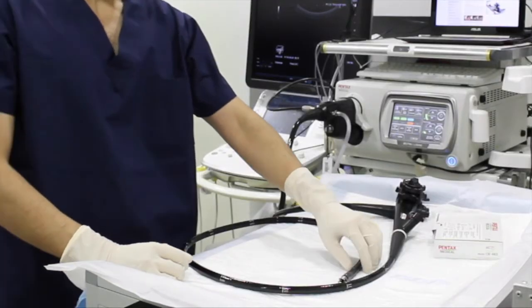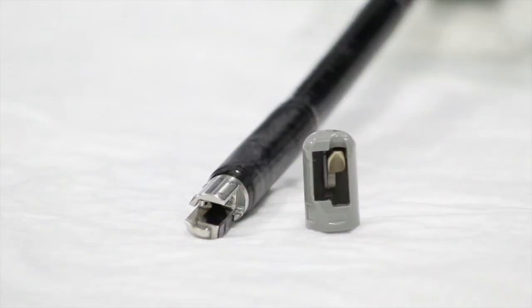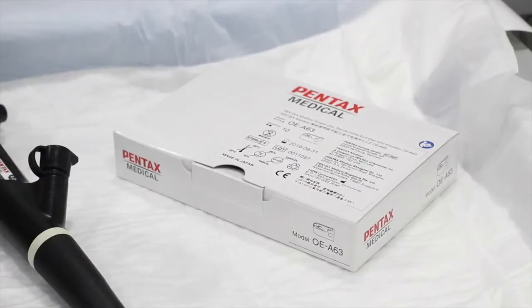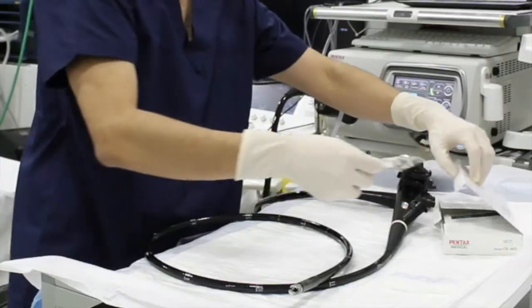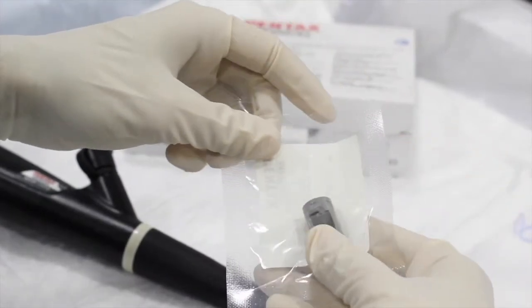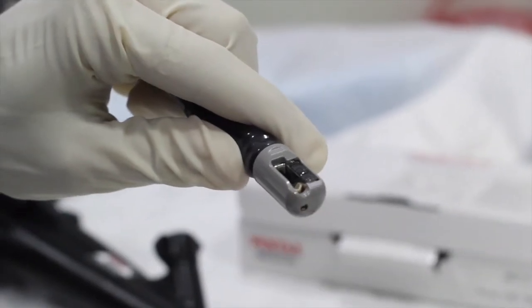Pentax Medical recently launched a high-definition duodenoscope with the advantage of a disposable cap and elevator that offers detailed visualization of the duodenal papilla for high precision in ERCP procedures. After the removal of the disposable elevator cap from the manufacturer's sterile package, the cap is placed over the tip of the duodenoscope and then the elevator is tested prior to the endoscopic procedure.